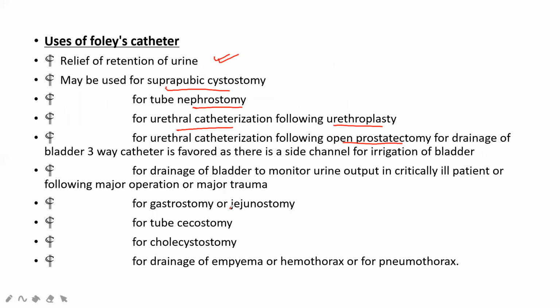Okay, now next is gastrostomy or jejunostomy tube or tube cecostomy, cholecystostomy, all these things, as well as for drainage of empyema or hemothorax or for pneumothorax cases. So remember the uses, it will be easier for you.